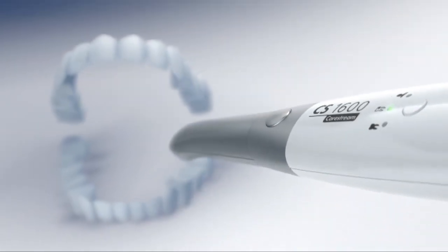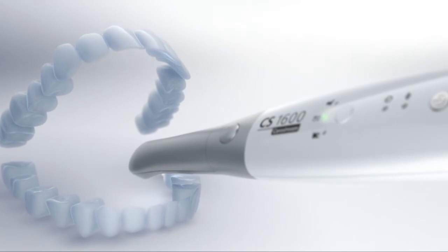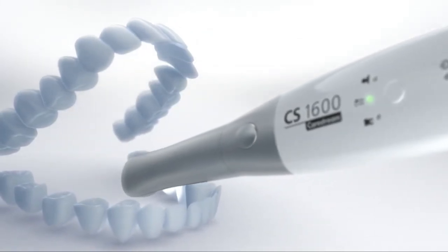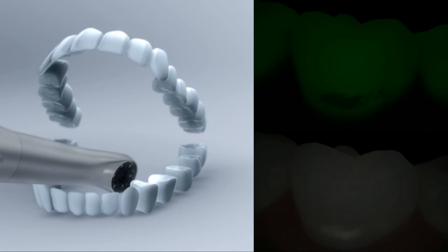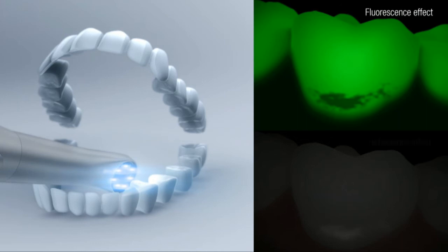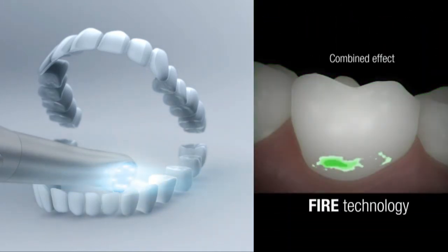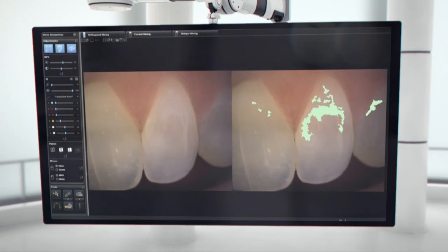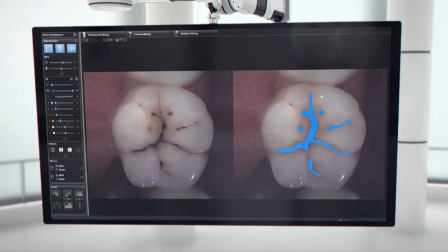For enhanced analysis, CareStream Dental's exclusive FIRE — fluorescence imaging with reflectance enhancement technology — reveals potential areas of concern. Numerical values and customizable colors correlate to the possible caries level. FIRE technology combines caries signals from both fluorescence and reflectance effects to generate the most sensitive results. The CS1600 aids in the detection of potential early and advanced caries, while adjustable sensitivity levels provide the greatest diagnostic flexibility.